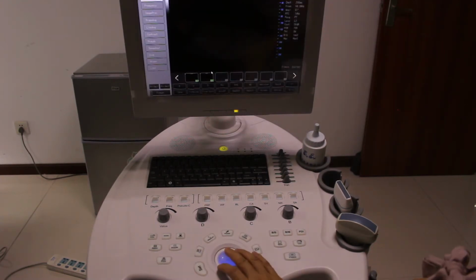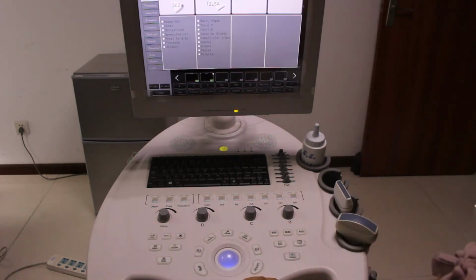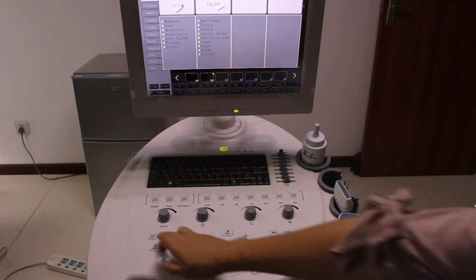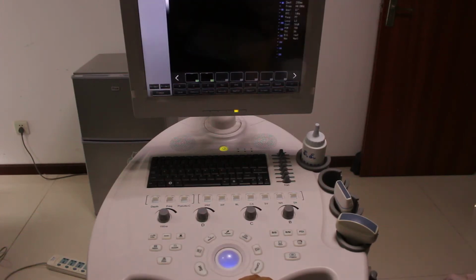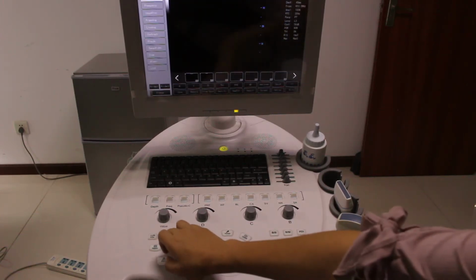And see, this is the probe. For this machine, they have two probes. We can press probe to choose the right probe, right report, right exam part. Let's say anything, thyroid or carotid, and you see. And this is 3D, 4D.